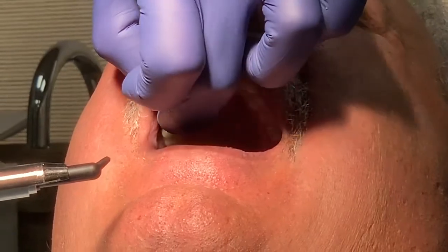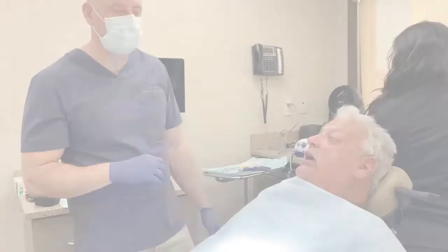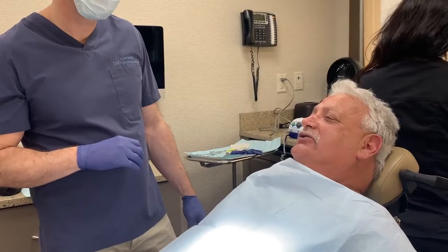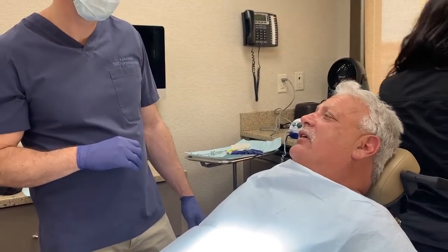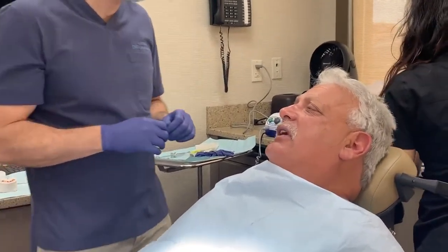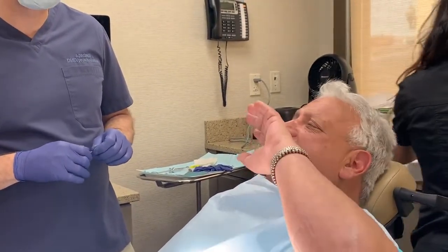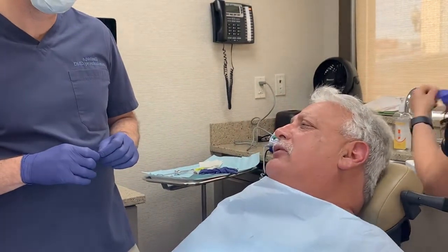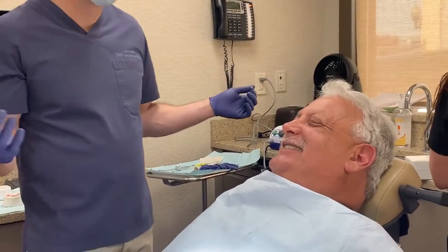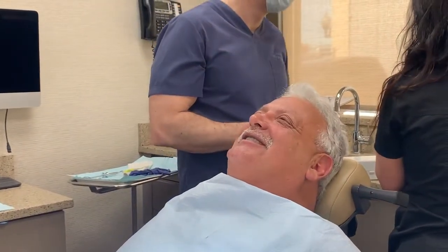And so, bite down for me. Open for me. Because you see where they are? To be honest with you, actually, the lip inside is a lot less. You can feel with my tongue. Yeah, it's less than the temporary, because with the temporary we needed the bulk for the prosthesis. I felt like a lot of food got stuck up there, especially peanuts and stuff like that. You like shelling peanuts?